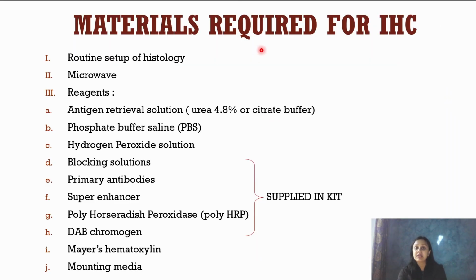Moving on to the materials which are required for IHC. Now, what are the materials required for IHC?